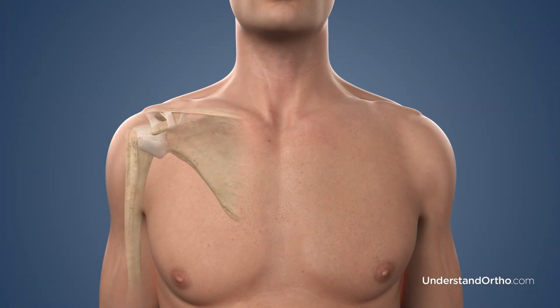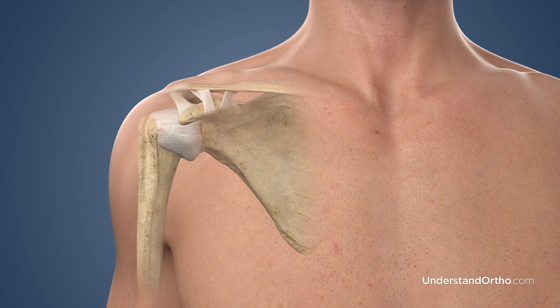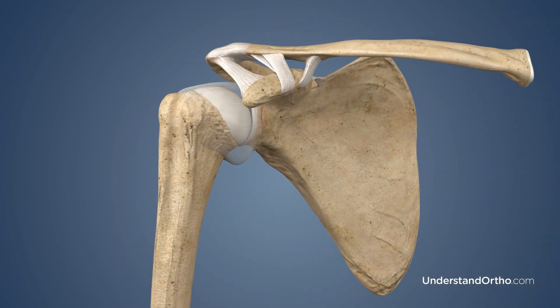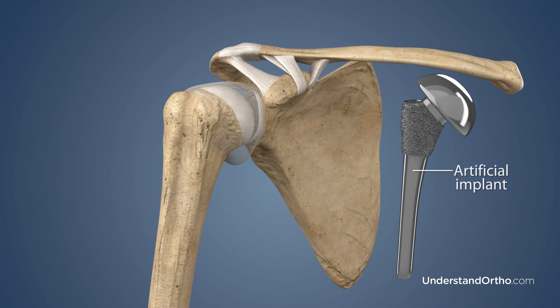Total shoulder replacement, also known as TSR, total shoulder arthroplasty, TSA, or anatomic total shoulder replacement, is a surgical procedure performed to replace damaged portions of the shoulder joint with an artificial implant.